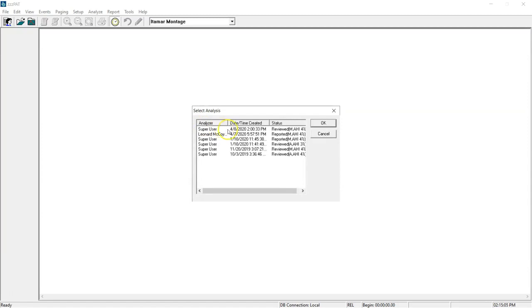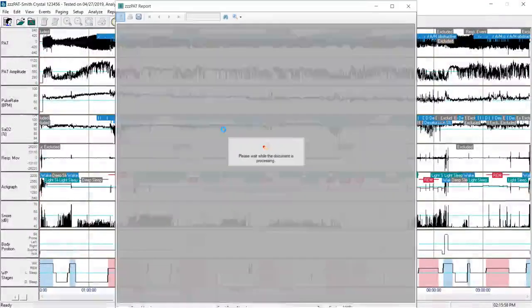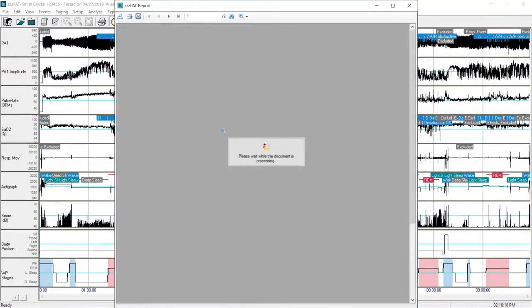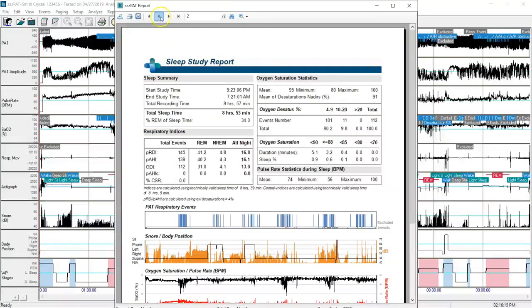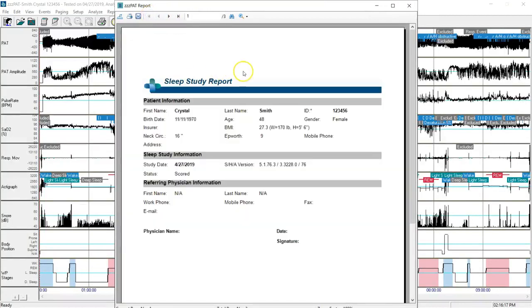If I've done multiple studies with her or multiple interpretations, they'll be available. I click on the top one. The entire study will load as well as the report. It goes to page two. I'll click back to page one just so I can verify that this is Crystal Smith.